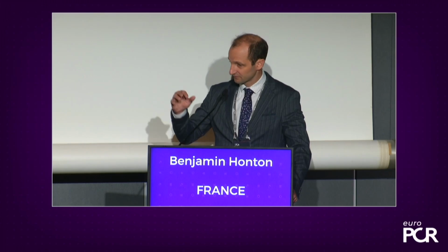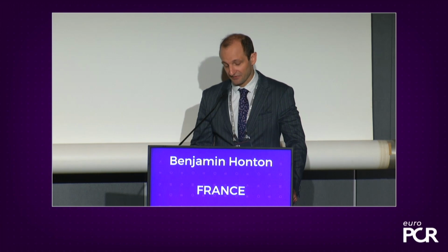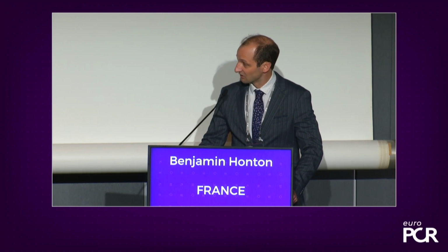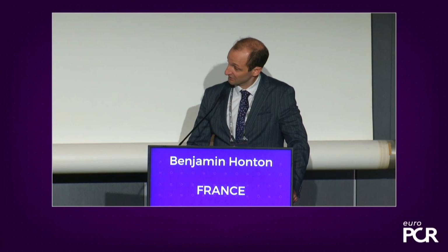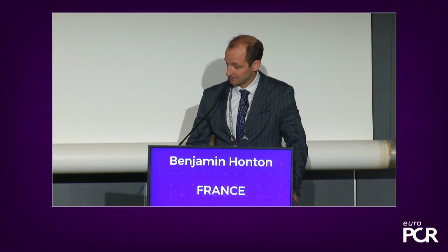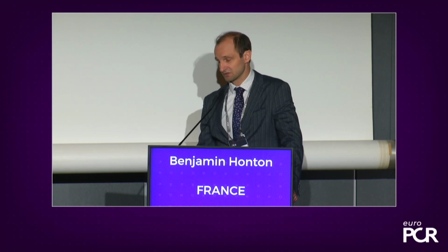You're right. It's an open question. There are multiple answers, I think. You have seen in the case that after only one cycle, there is no footprint on the mid-LAD. So I will keep the pulses for the rest of the lesion if I have a long lesion to treat. It's again a costly therapy, and we know that there is no heat on the vessel wall. So I'd like to use the whole therapy, the whole pulses of the catheter. This is crucial, but it's an open question. I don't think that the science can give an explanation.